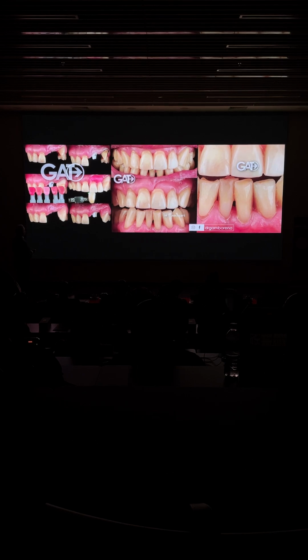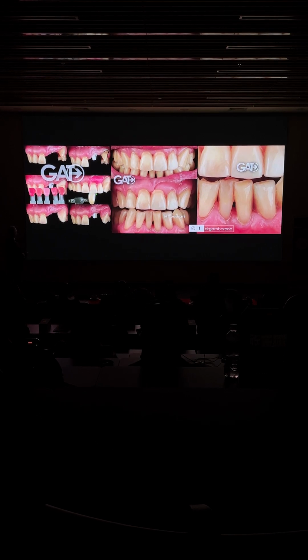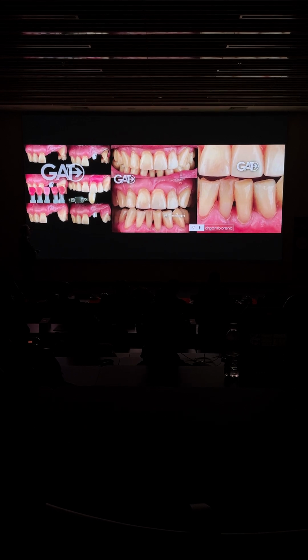This is from when I used to have my Instagram, before it was hacked, and you can see here the picture of the same implant 11 years down the road. This is a removable partial denture on this patient who is 82 years old, and with the advent of zirconia, full contour zirconia teeth, we do removables with zirconia teeth, which he loves.